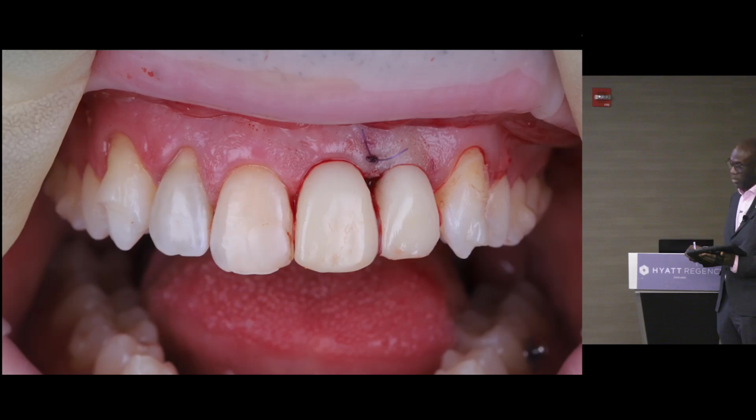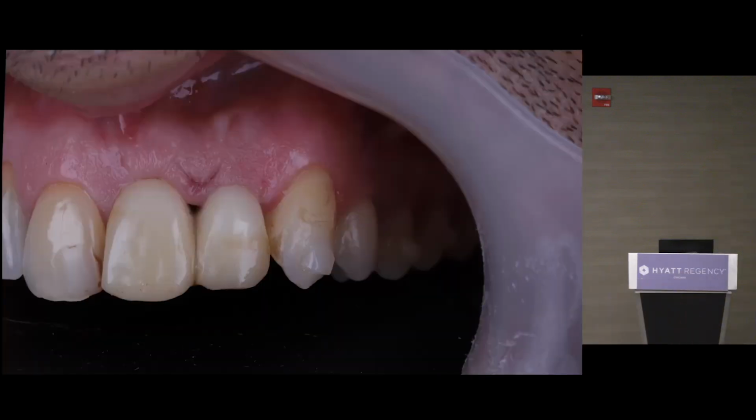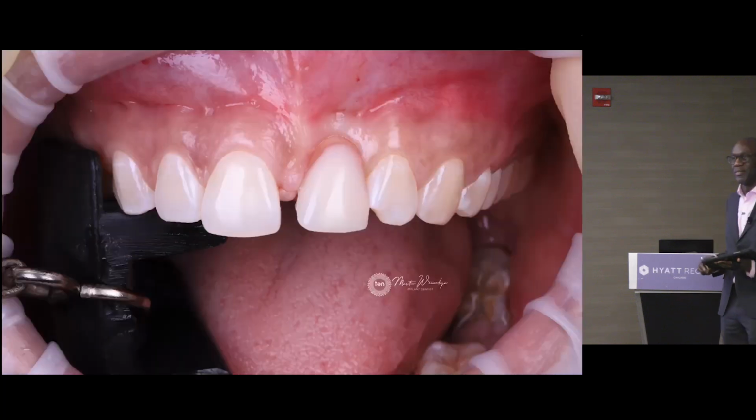This is the patient pretty much at the end of surgery. This is them having healed. And we can see that papilla creeping down nicely for the patient over time, just there. And this is the patient as he's left, and we'll see that papilla creep down. Unfortunately for me, he's gone off to South America, but he says he will be back at some point for us to finish everything when he's done.